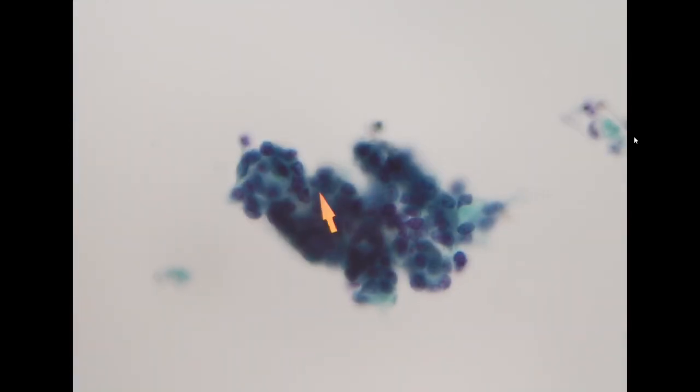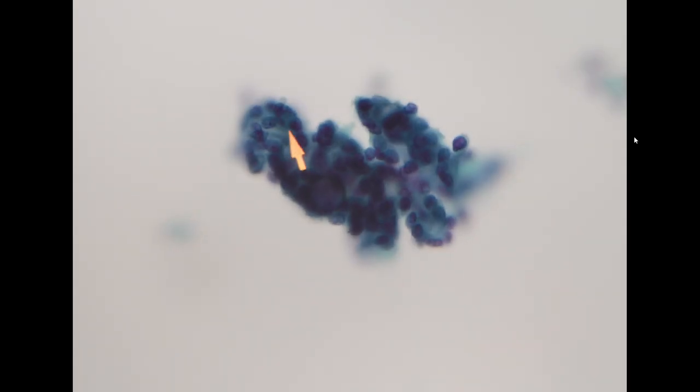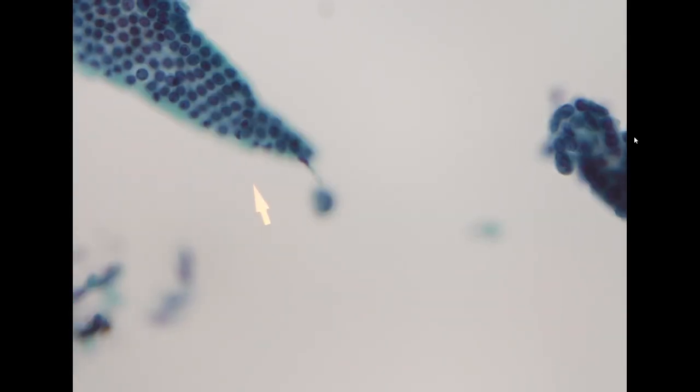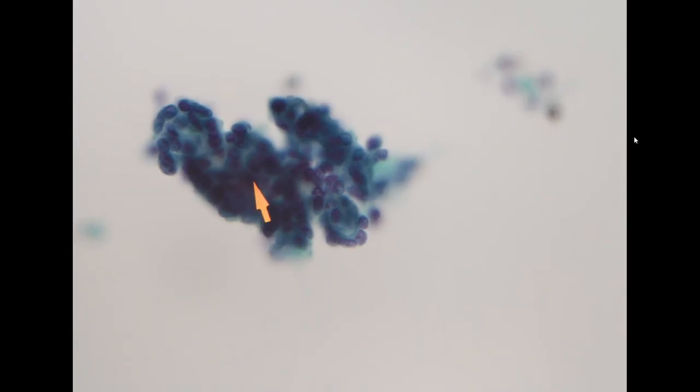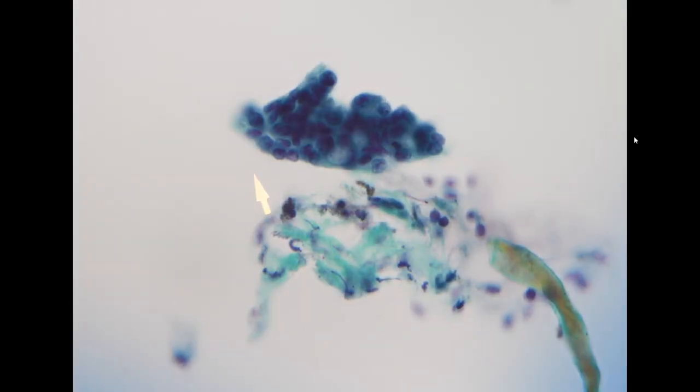Right next to it, you find a cluster of highly overlapping cells with a marked hyperchromatic chromatin pattern. So this is definitely different from the benign cluster. So this is adenocarcinoma. If we can find some clusters, it's easier to appreciate, like this one.